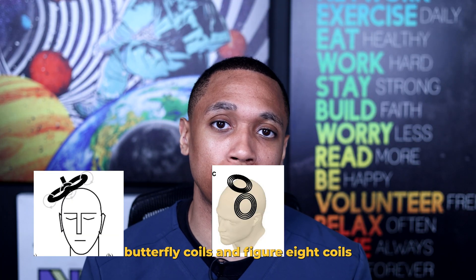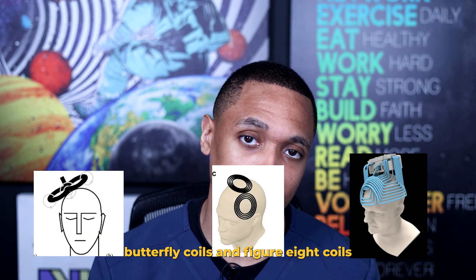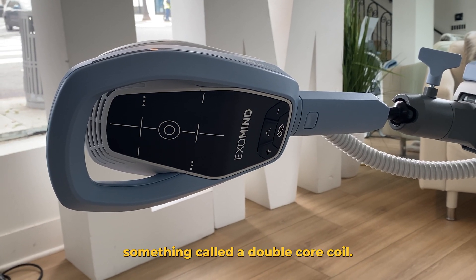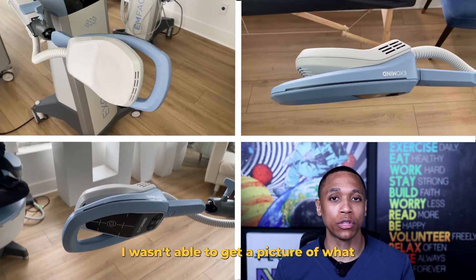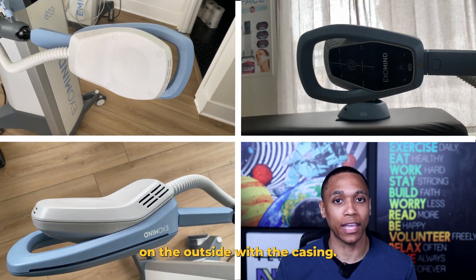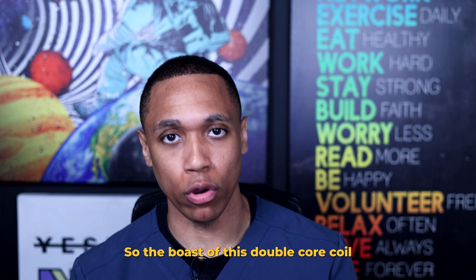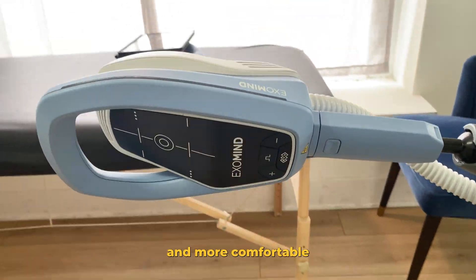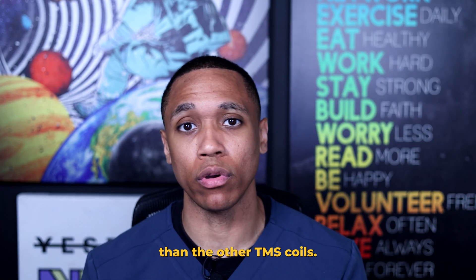So far I've talked about flat coils, butterfly coils, and H coils. But it's my understanding that ExoMind uses something called a double core coil. I was unable to get a picture of what the double core coil looks like, but we can take a look at what it looks like on the outside with the casing. The boast of this double core coil is that it is easy to place, stronger with a faster response time, and more comfortable than the other TMS coils.